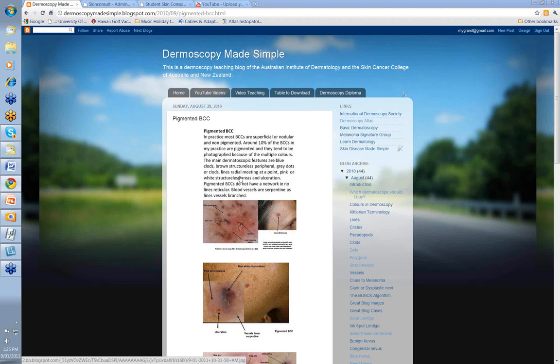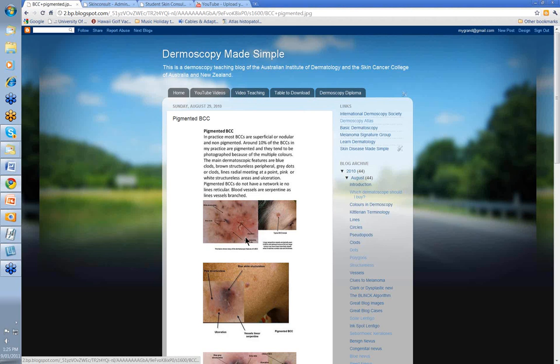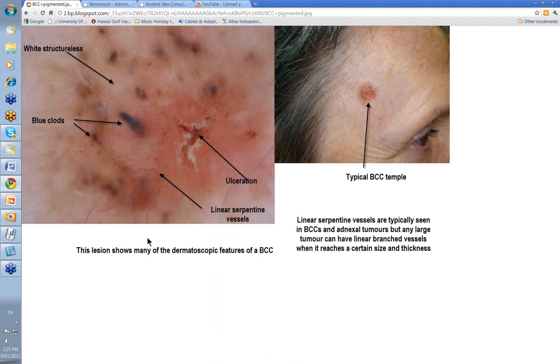So that's an overview of pigmented BCCs. Remember, you're going to see blue clods, brown structureless peripheral, grey dots or clods, lines radial meeting at a point, pink or white structureless areas, and some ulceration. Let's have a look at these.